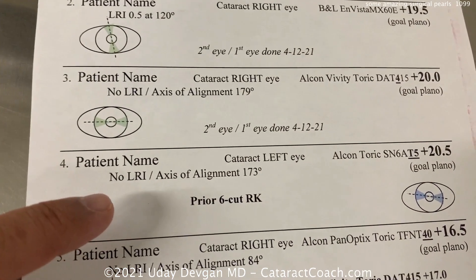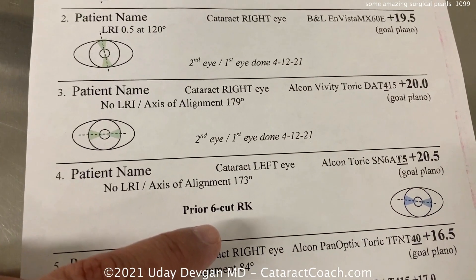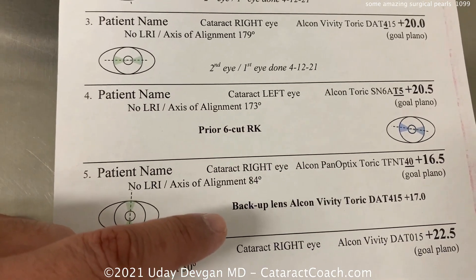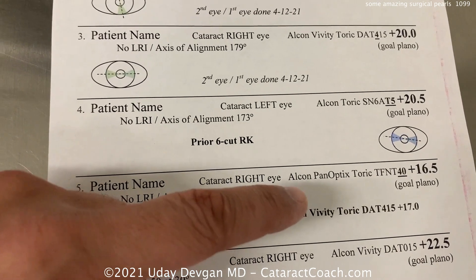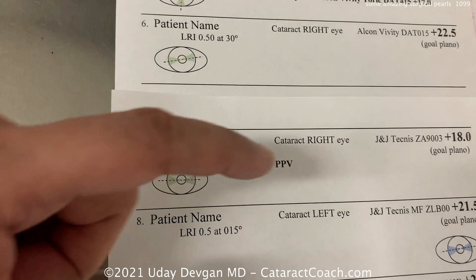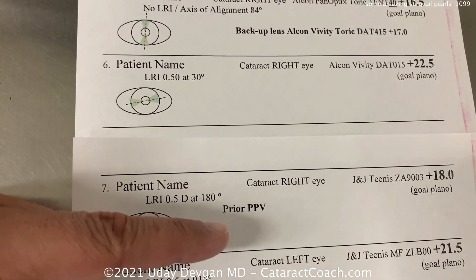This is a special situation: this patient has six-cut RK, which is going to make things a little different. And here, this patient — I have a backup lens and we still haven't decided between a trifocal or EDOF lens.